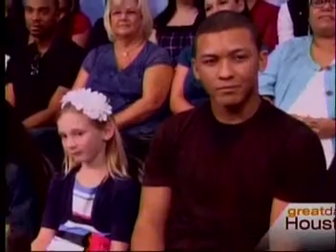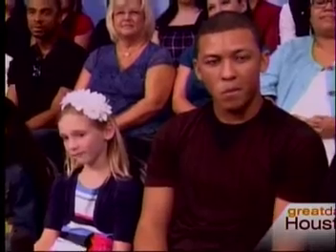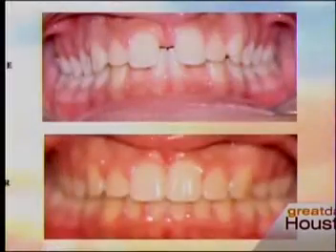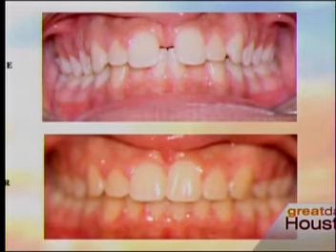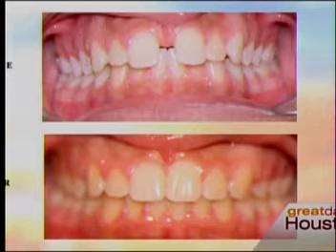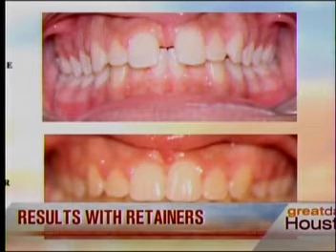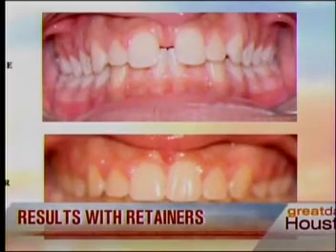And then the retainer is for anyone who gets their teeth straightened, or it just depends on the situation? Anyone who has braces needs to wear retainers after the treatment is completed to prevent teeth movement. Yeah. And so this is a before and after picture of Ethan. He was mainly concerned about the spacing in between his 2 front teeth, and that's his final image. And because he's worn his retainers so well, he has a beautiful smile still. All right. And so, again, those retainers for the rest of your life? Pretty much, yes. I always recommend, as long as you want your teeth to stay straight, wear your retainers.